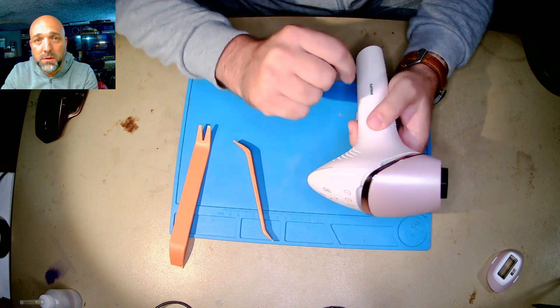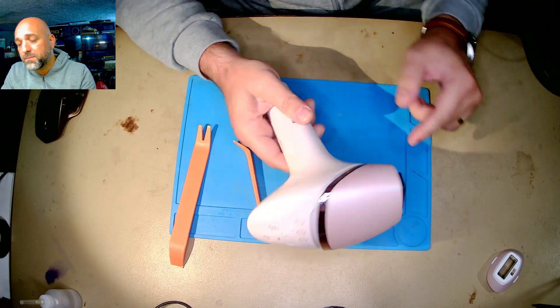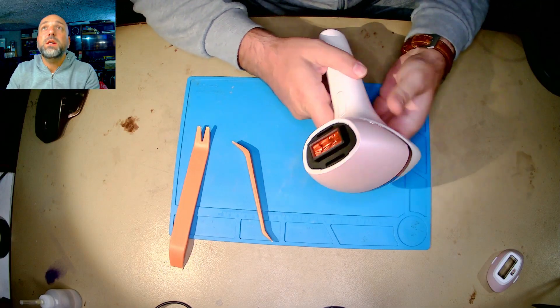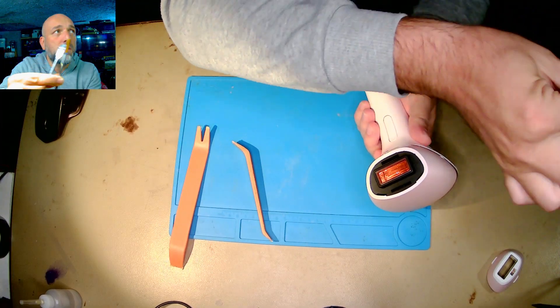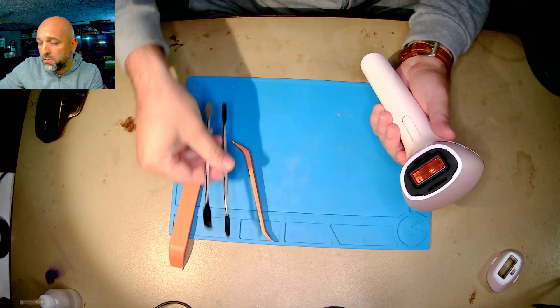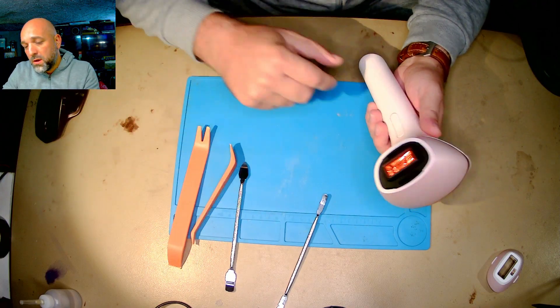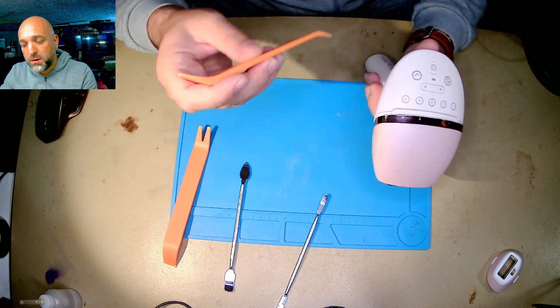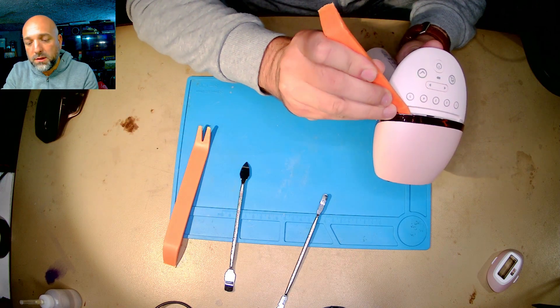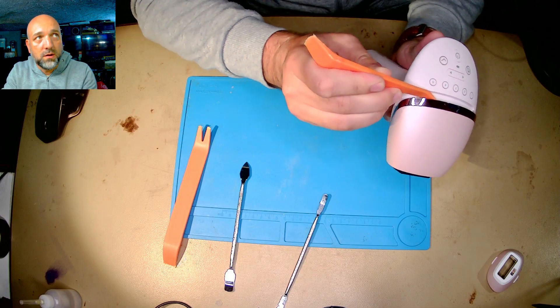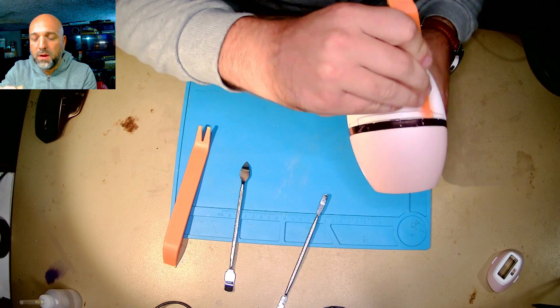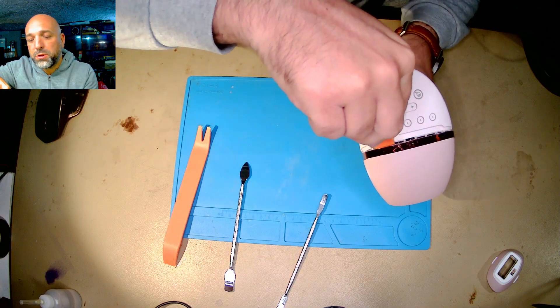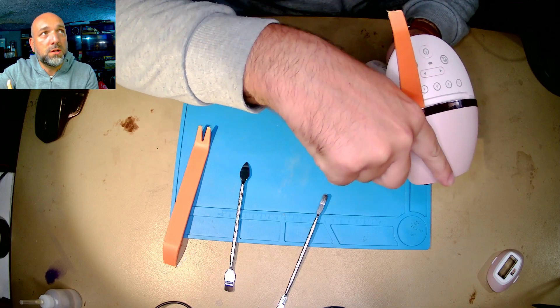You will start by inserting the plastic tools here on this side and on this side, and try to push here, so downwards. Also here on this area there is a plastic clip that needs to be removed.